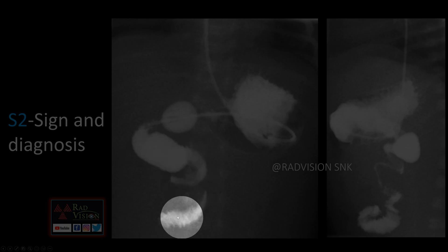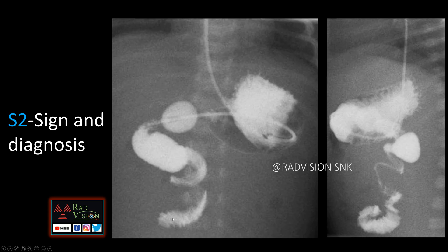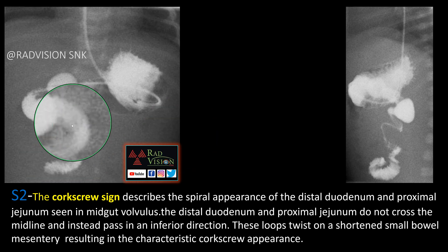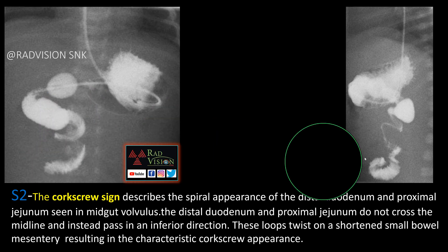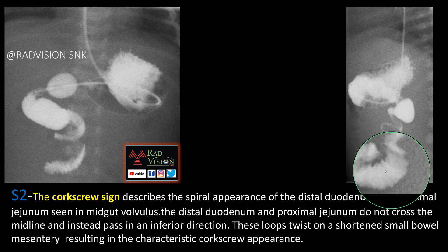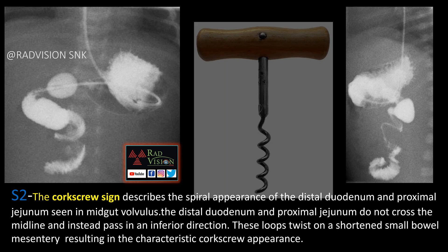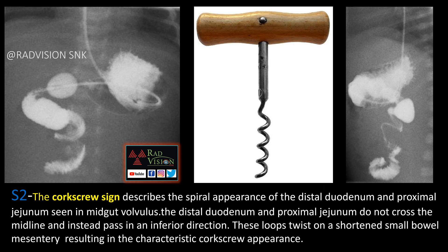Next sign — here you can see the duodenum and the jejunum are coiled and not crossing the midline. This is a case of the corkscrew sign, seen in midgut volvulus. The distal duodenum and proximal jejunum are coiled and resemble a corkscrew appearance; they do not cross the midline. These loops twist in a short small bowel mesentery, resulting in the characteristic corkscrew appearance. Remember: corkscrew sign in midgut volvulus.